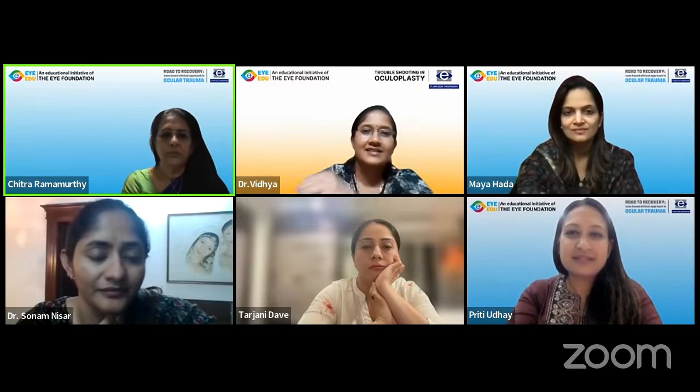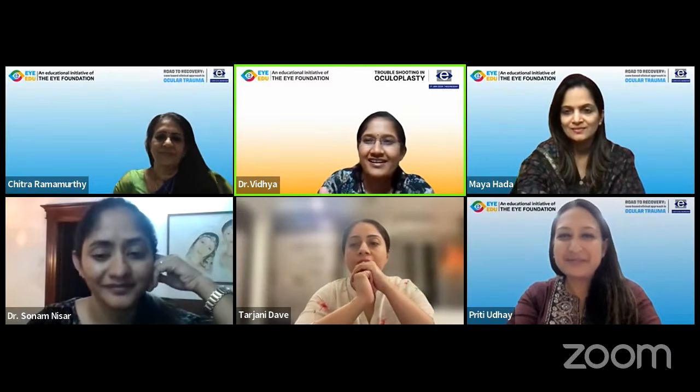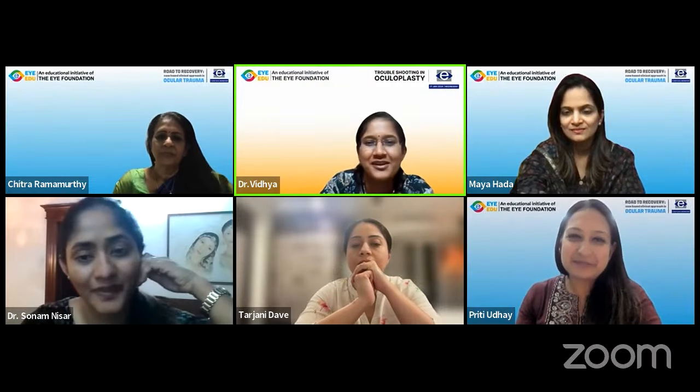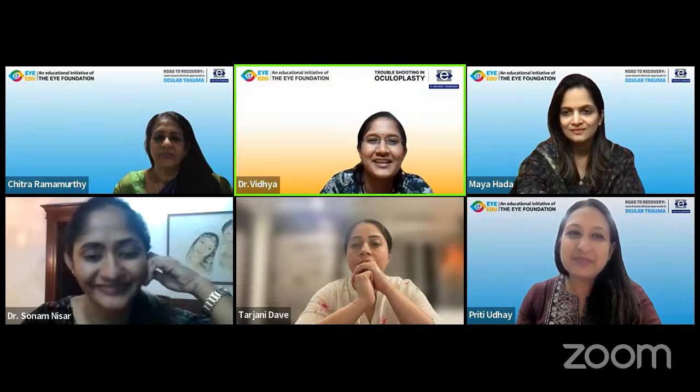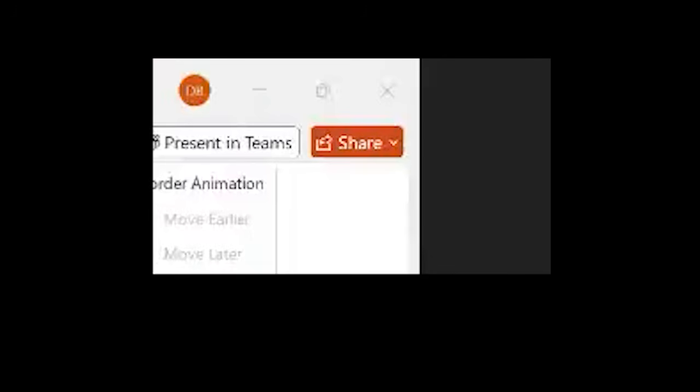Vidya, you're muted. Yes. Thank you so much, madam, for that wonderful talk. I don't have personal experience in PSI or in navigational surgery, so you can consider these questions as very layman's questions. What happens if our navigation fails when we are doing the surgery? These are like high-stake patients. Do we have any safety net in place? Do we have any backup data when we do this?